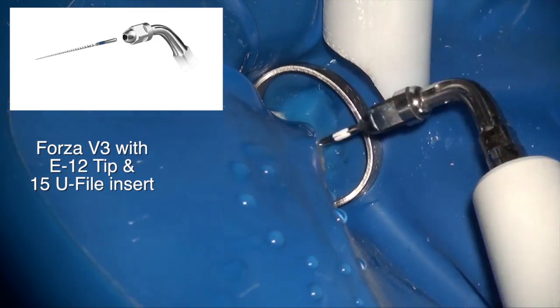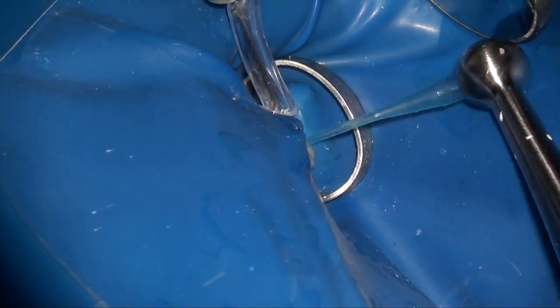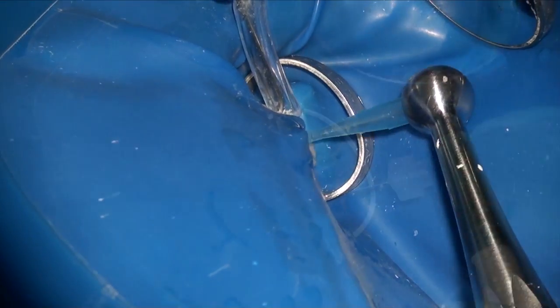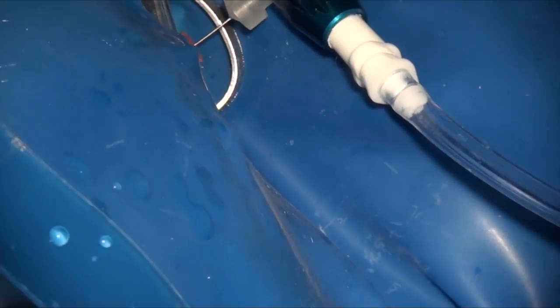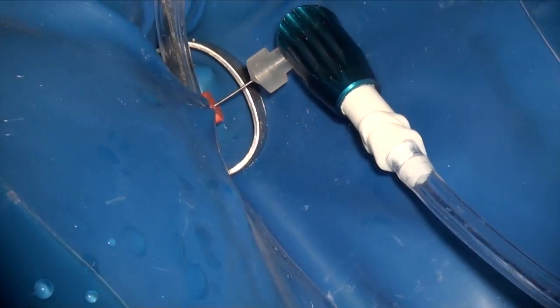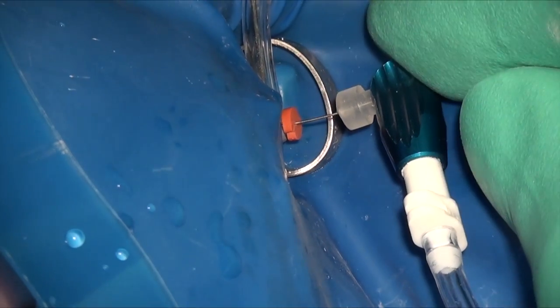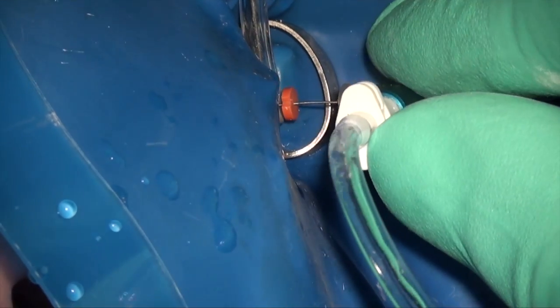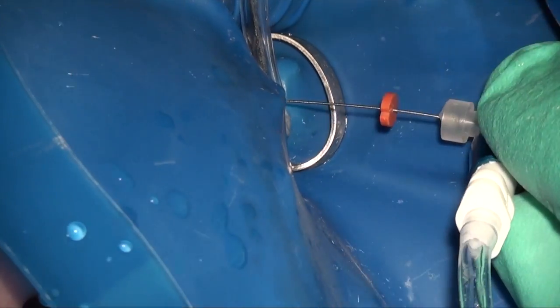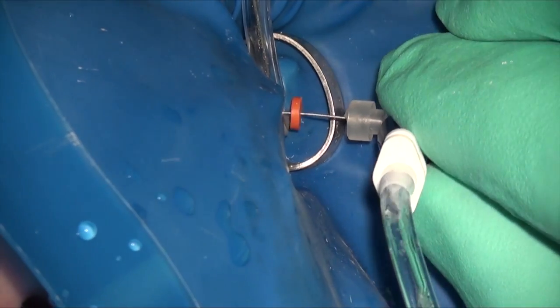So once both canals have been prepared to size 45, now it's time to do our final disinfection. And using hypochlorite, I use the macro cannula, I use a negative pressure system. Here's the EndoVac, followed by the micro cannula. This is the small tip. Basically what I'm doing here is the vacuum tip from this micro cannula is going all the way down to the apex, and you can see that my full strength hypochlorite is reaching the apex and then coming back up through this little nozzle, through the vacuum, and through this little tubing out of the canal. This is a very good way of safely running a very high volume of disinfectant down the canal.